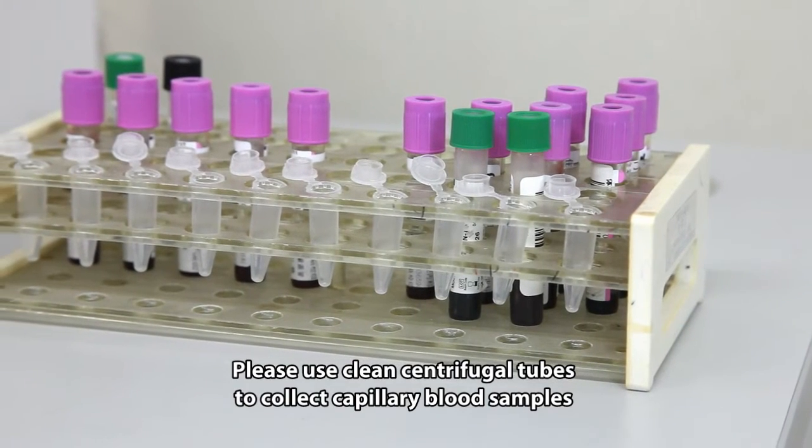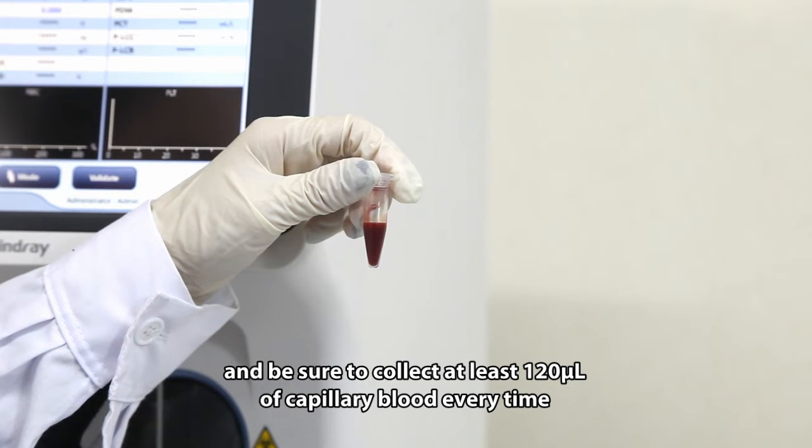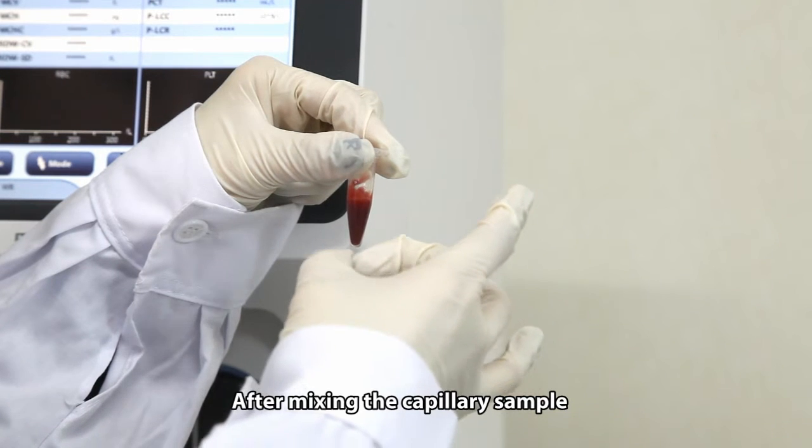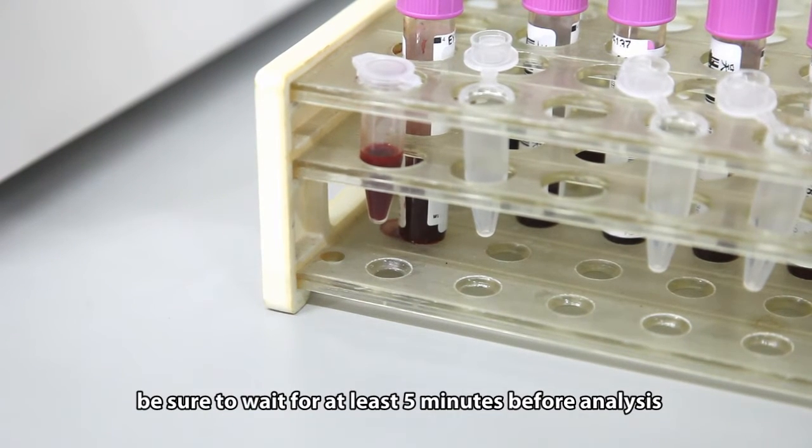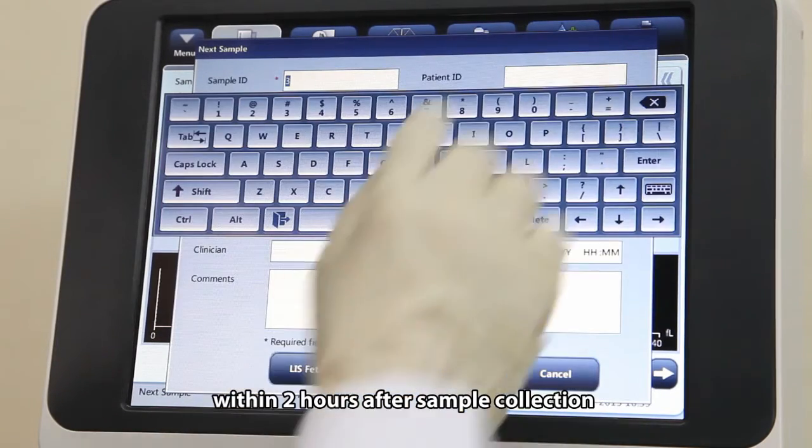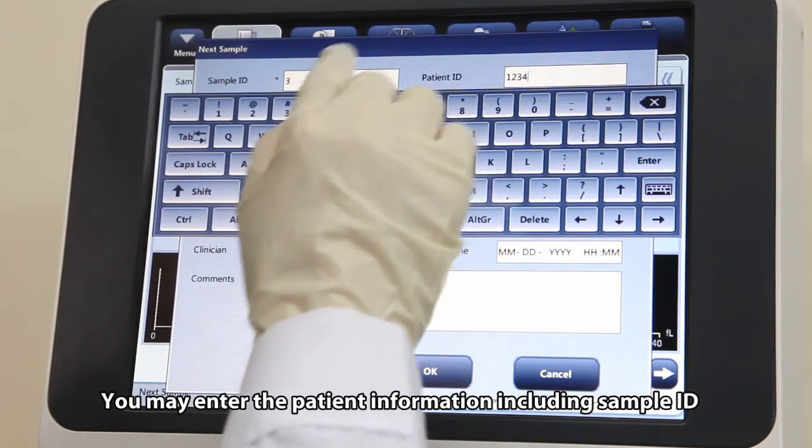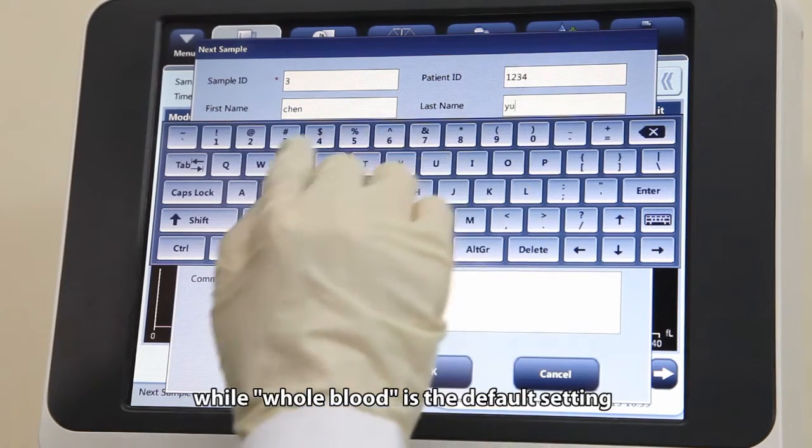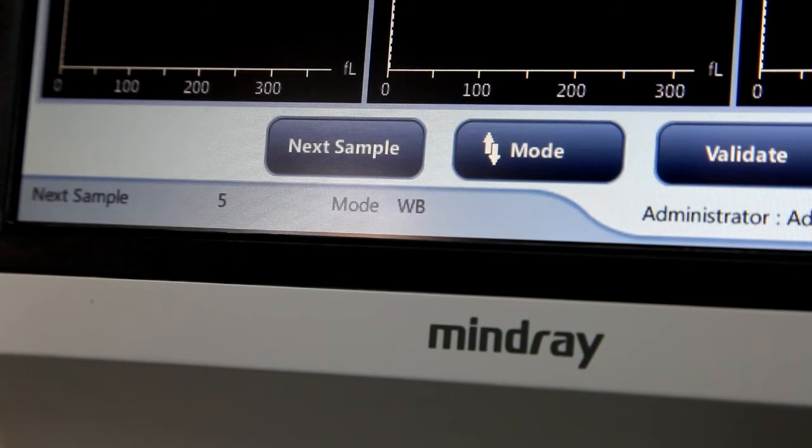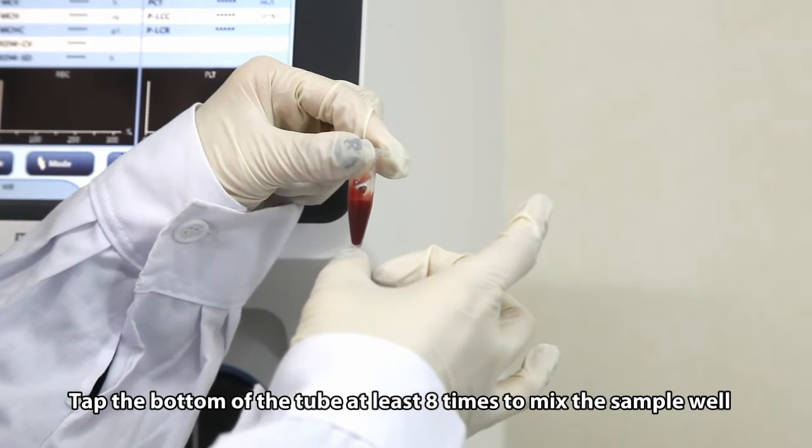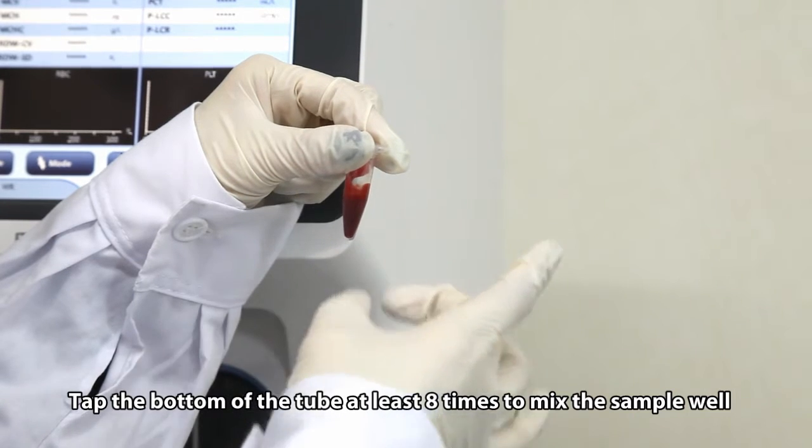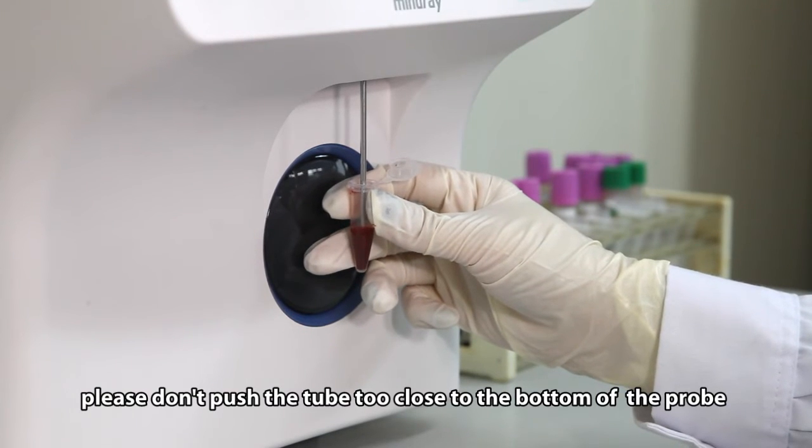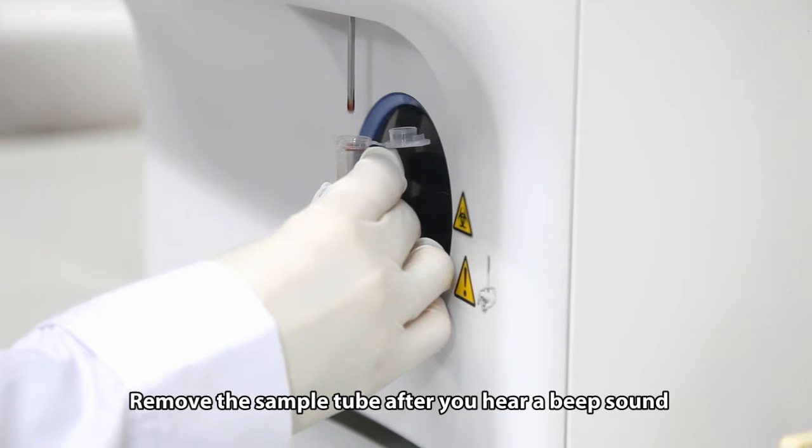Please use clean centrifugal tubes to collect capillary blood samples and collect at least 120 microliters of capillary blood every time. After mixing the capillary sample, be sure to wait at least 5 minutes before analysis and complete the analysis within 2 hours after sample collection. You may enter patient information including sample ID, name, age, gender, while whole blood is the default setting. Tap the bottom of the tube at least 8 times to mix the sample well and run it through the sample probe. To prevent blood blockage, don't push the tube too close to the bottom. Remove the sample tube after you hear a beep sound.